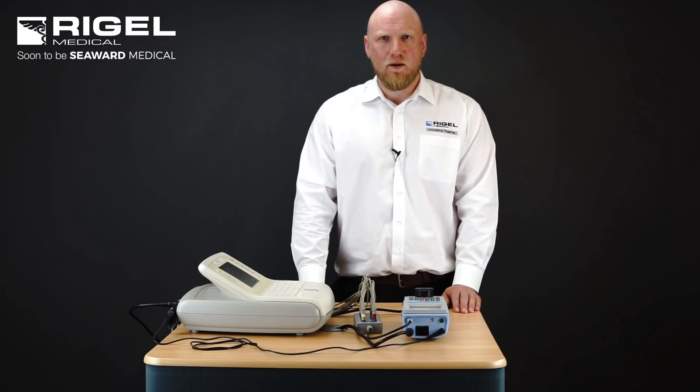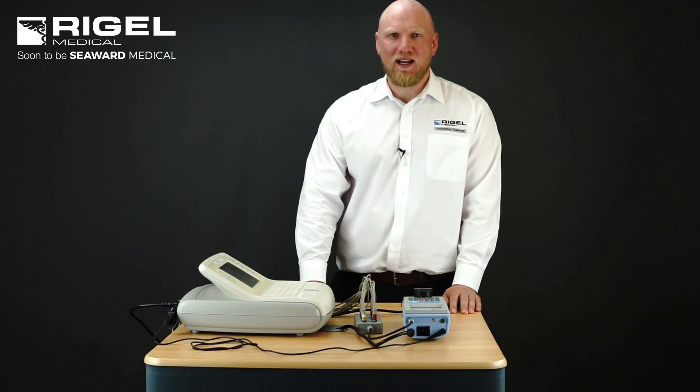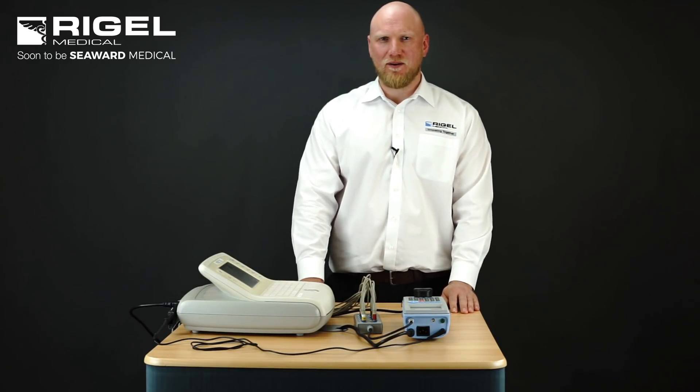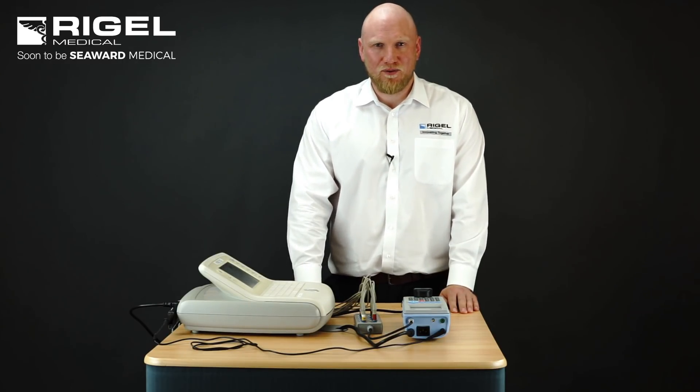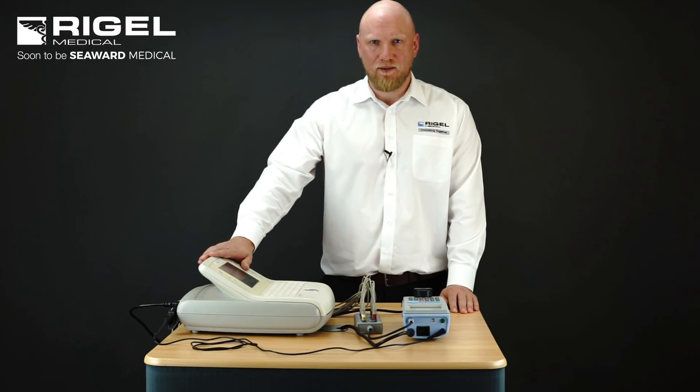It's small and compact with direct printing via Bluetooth connectivity. The purpose of this video is to highlight the differences when testing under IEC 60601 and IEC 62353 when testing a medical device.